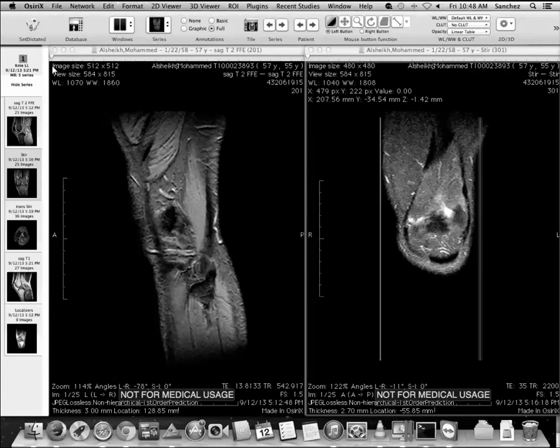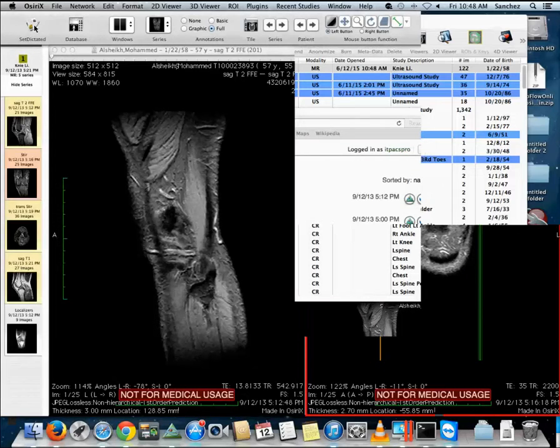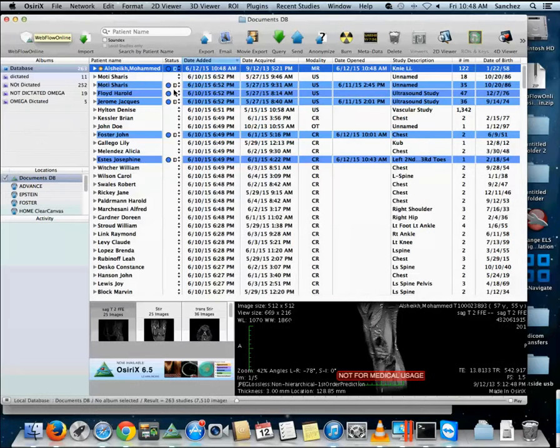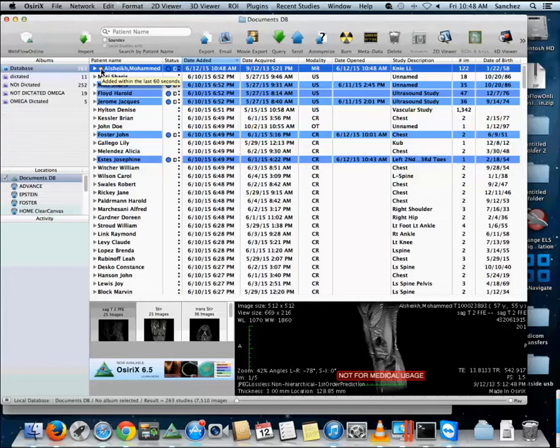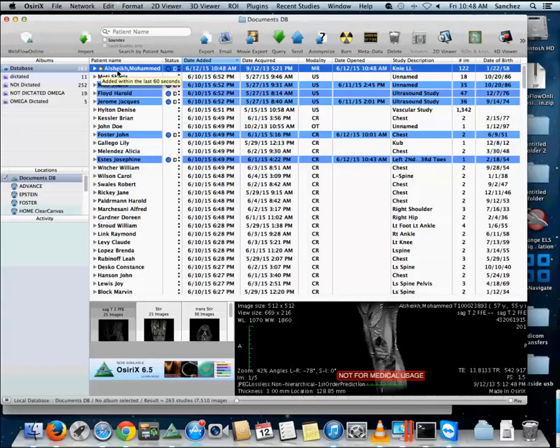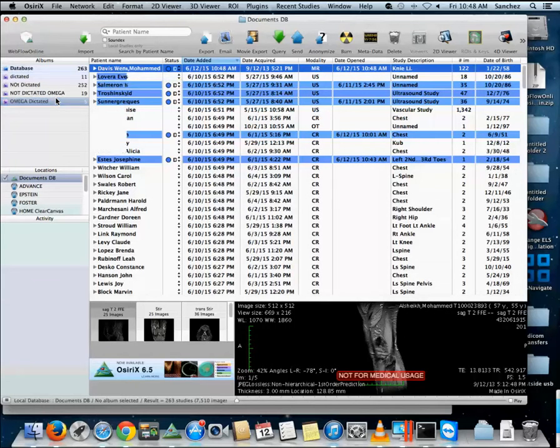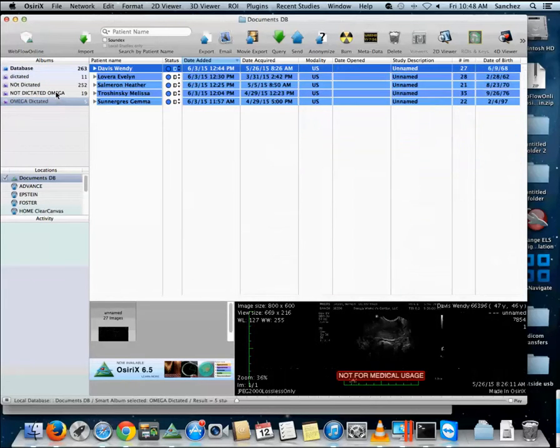So as we can see the study has arrived, it automatically opened. We'll go ahead and mark this dictated. We can see the study here is the very first one, there's an orange circle next to it informing us that it was added within the last 60 seconds. And that would be the workflow.